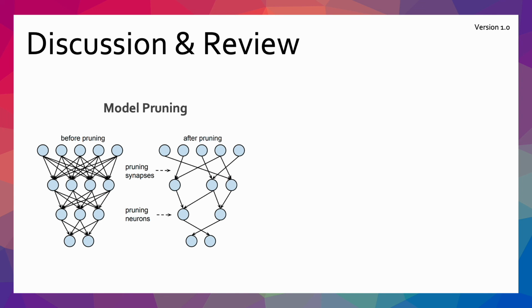After the deep learning model is exported, it is quite large, close to 500 MB, which can be troublesome in deployment in resource constrained environments. Also, it leads to longer inference times. So, another area worthy of exploration is compressing and pruning the model to reduce its size.